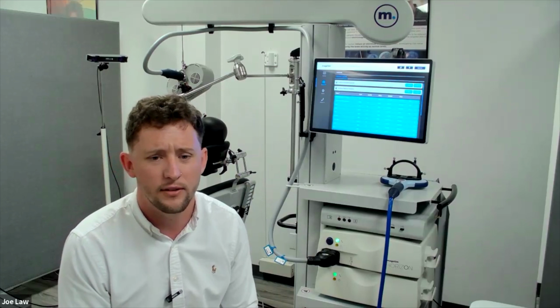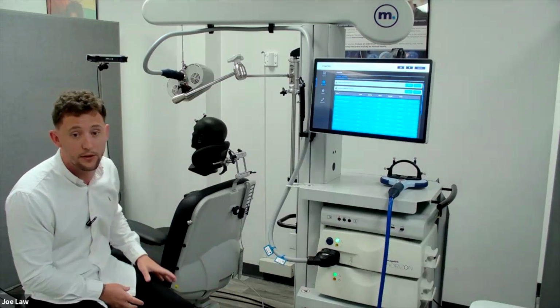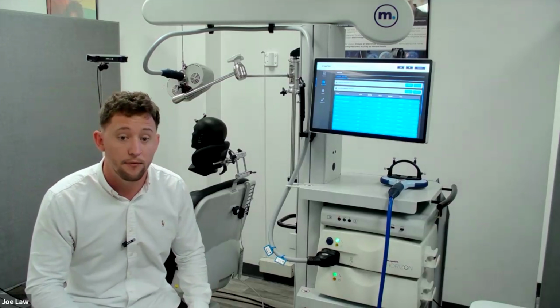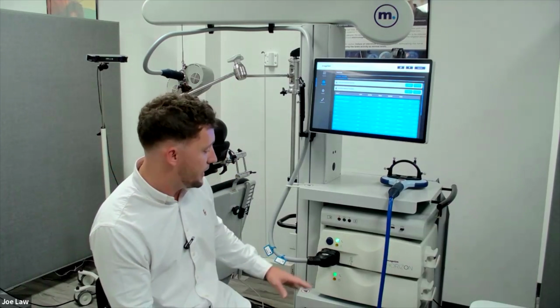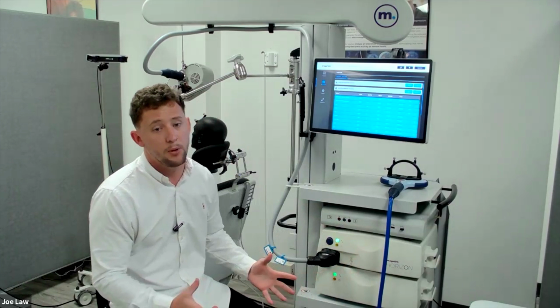That can usually take around an hour and a half, but it is done by a Magstim rep. And then if, for example, you want to send the coil back after, let's say, 5 years to do a safety test, we can usually turn that around within a couple of days. Again, the beauty of the system is the way we've designed it is everything is very modular. And we've done that purposely.